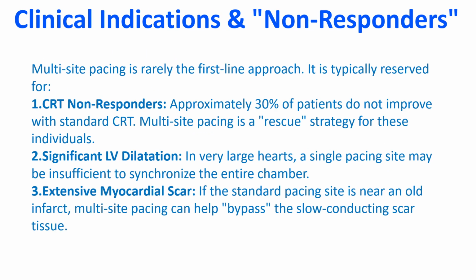Multi-site left ventricular pacing is rarely the first line approach. It is typically reserved for CRT non-responders. That is, approximately 30% of patients do not improve with standard CRT. Multi-site pacing is a rescue strategy for these individuals. Significant LV dilatation: in very large hearts, a single pacing site may be insufficient to synchronize the entire chamber.